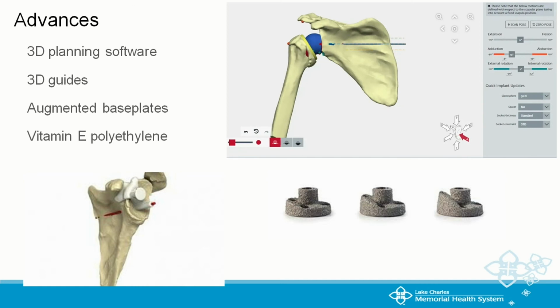and that's a problem with total shoulders, them dislocating. And now we've got these nice little reamers, things that drill the bone and make it into a better socket, so I can put something there that matches your old anatomy to compensate for any bone loss you may have on the glenoid.